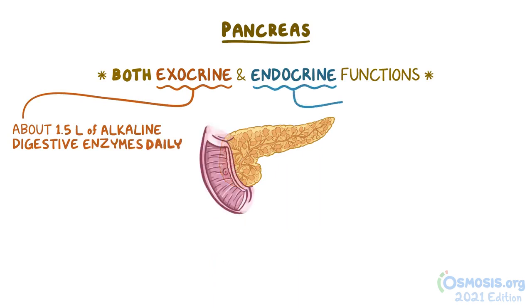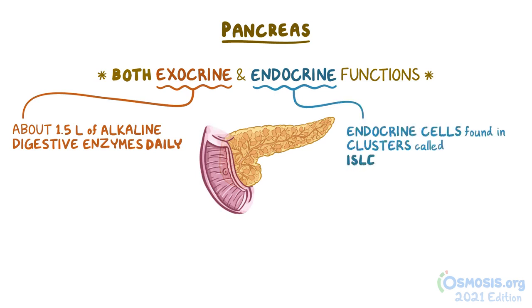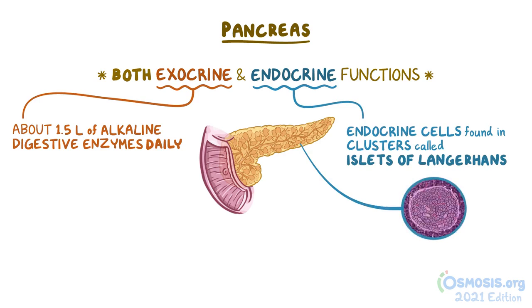The pancreas also contains small endocrine cells found in clusters called islets of Langerhans, which typically stain lighter than the pancreatic tissue around them.